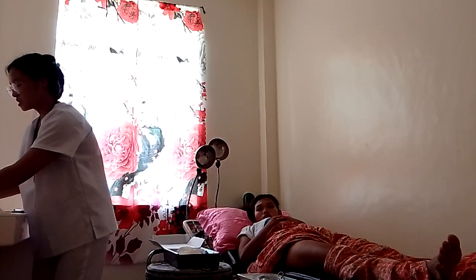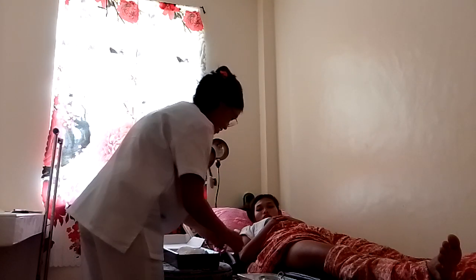Okay. So, we need to open. Okay. So, I have here, also have here. Okay. So, after that one, we need to open bottle of solution. So, dry dressing is siya, if ordered, and pour into sterile basin. So, ato siyang i-open. Ato ang bottle. Then, we need to pour into a sterile basin.